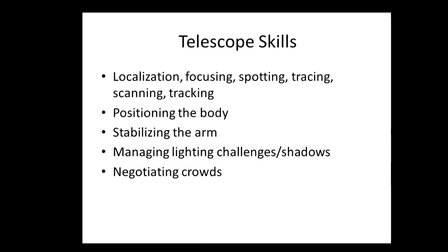Negotiating crowds is going to be an issue as well, depending on the setting. When you use a telescope, you have to stand still. If you're in the flow of pedestrian traffic or in a crowded grocery store, this can be awkward. It's a good idea to teach your students some stock explanations to use when they need to do this. I was working with one young student and his telescope at a grill-type restaurant at the Capitol when a huge group of people started streaming in.